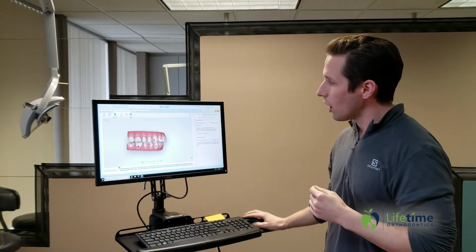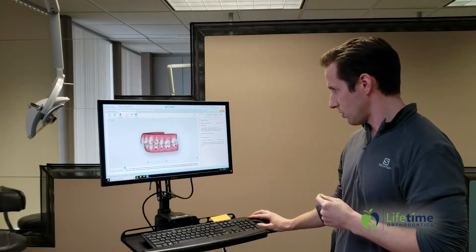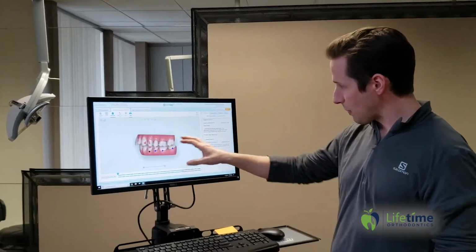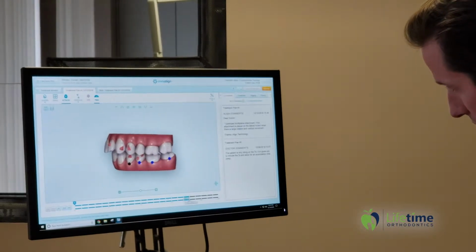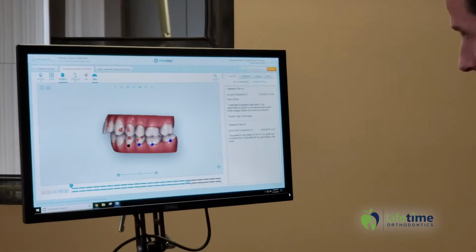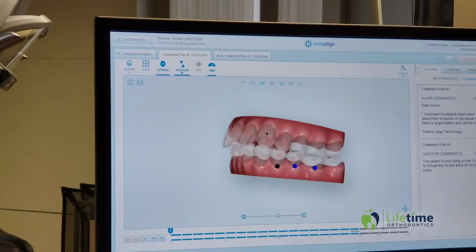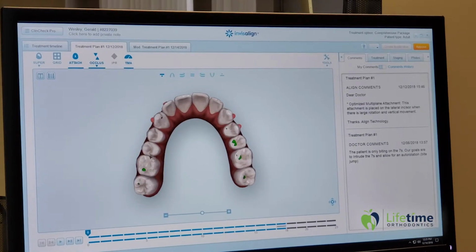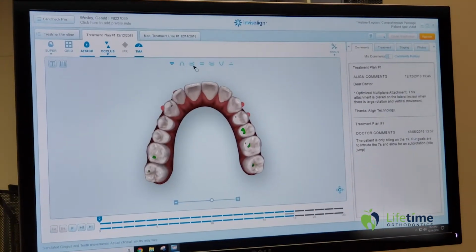So, anyways, what do I get back here? This is what we get back. We get this 3D image, okay? And you'll see this is treatment plan 1. I sent in my notes and everything. And what they have done is they've got this done in 18 trays here. I'll just show you quickly the software. What I can do is show where I'm hitting, okay? So these green spots are my contact points. So we should have contacts on all of these teeth. And you can see I'm only hitting on my back teeth, okay?